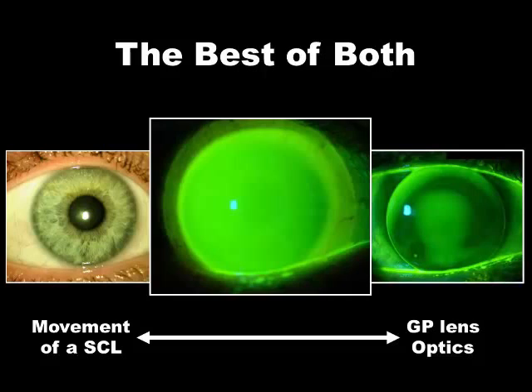So I would say that probably best corrected visual acuity with your corneal GPs or your sclerals are going to be similar, but the difference might be how much fluctuation exists. You can imagine a small corneal GP, if it's moving a lot, its optic zone might be crossing the pupil margin, creating some fluctuation in the patient's vision.